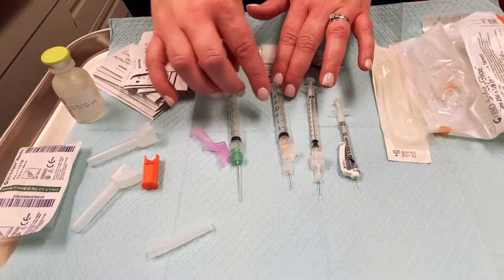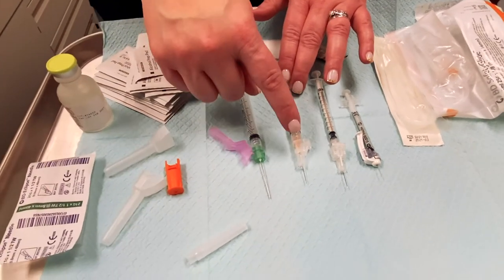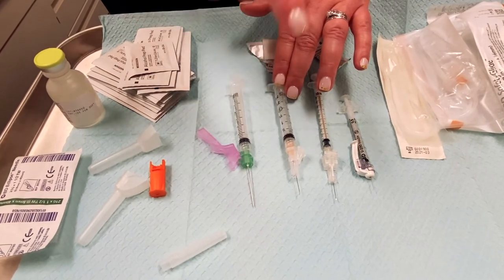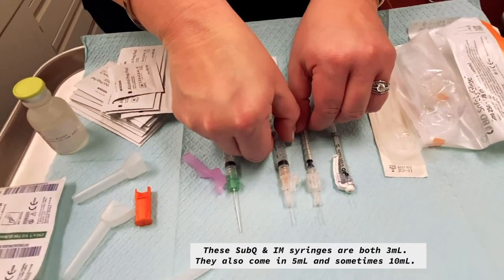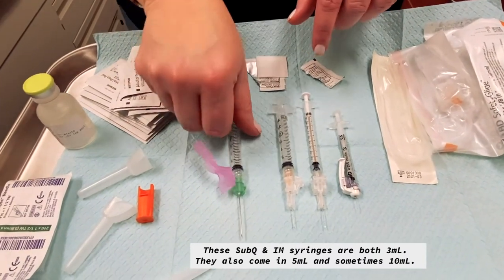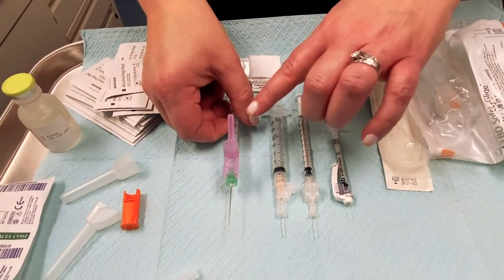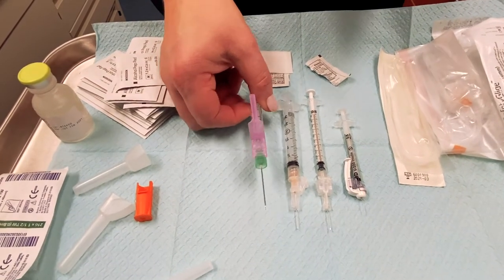Then we have our subcutaneous injections, syringes and needles — these are 25 gauge and they are 5/8 inch long also. You can see that these two are actually the same length; it's just that this 25 gauge is bigger than this 27. And then lastly we have our intramuscular needle, which is 21 gauge and one and a half inches long.